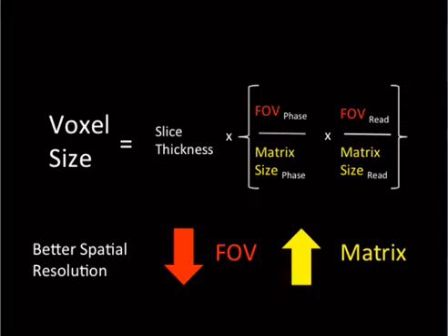Your field of view decreases a lot because with your naked eye you can see the entire wall or table, but in the microscope you only see a small amount, yet your spatial resolution is way better. Matrix is like the movie The Matrix: you can see things better once you have a better grasp of the matrix. That's how I keep that straight, or you can just remember that they're opposite.